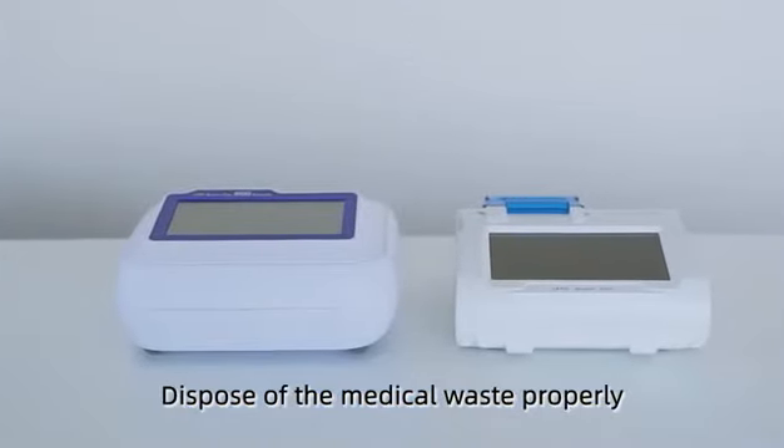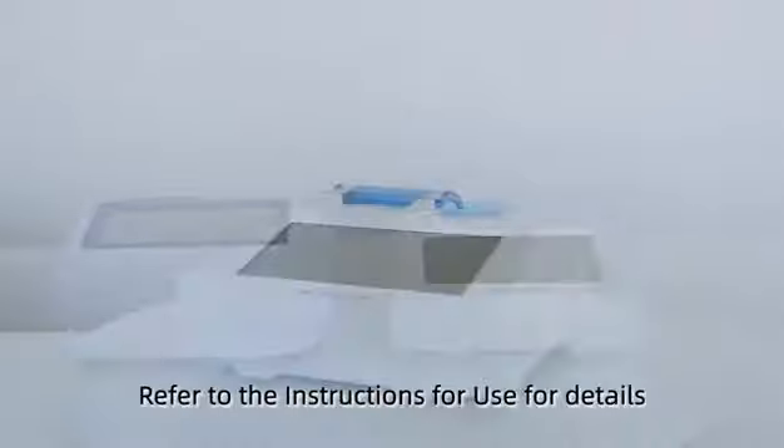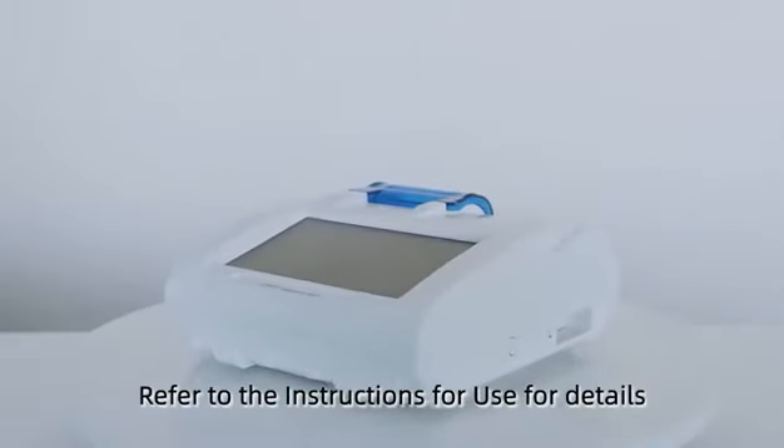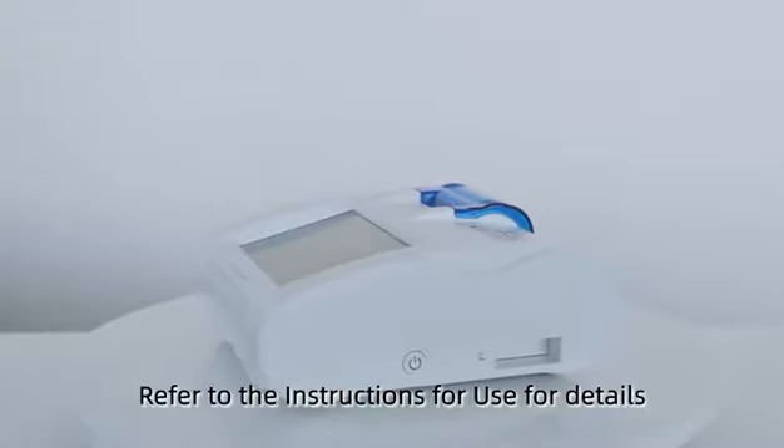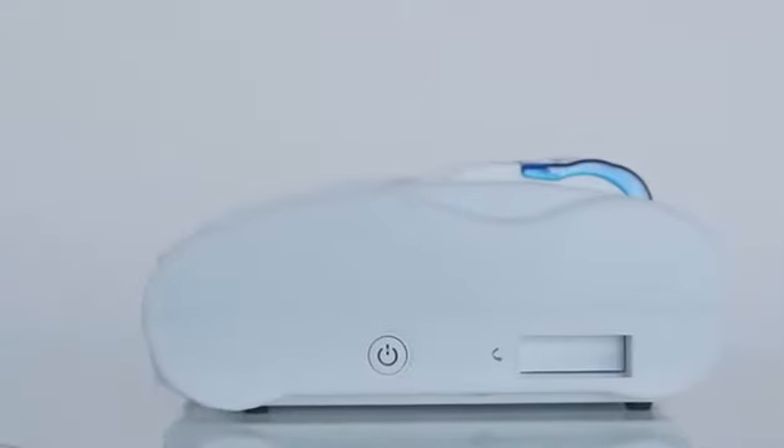Dispose of the medical waste properly. Refer to the instructions for use for details.